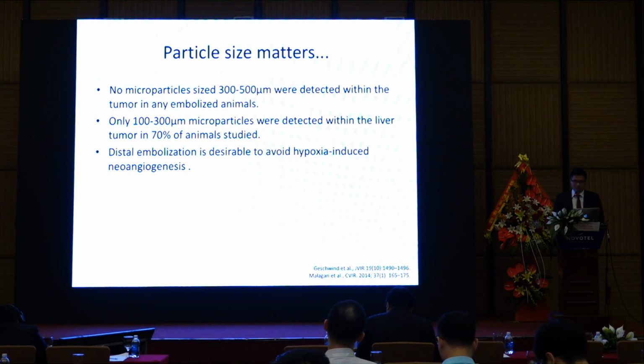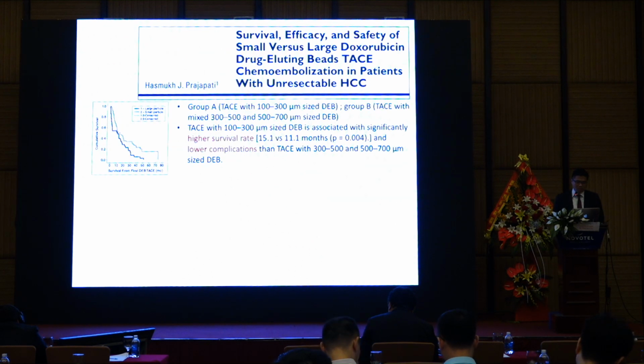So particle size does matter. In an animal study, particles smaller than 300 micrometers could be detected within the liver tumor, while beads larger than 300 were detected only outside of the tumor.